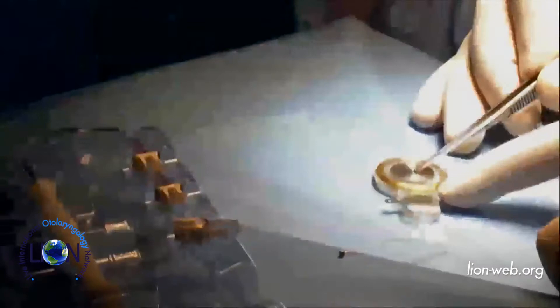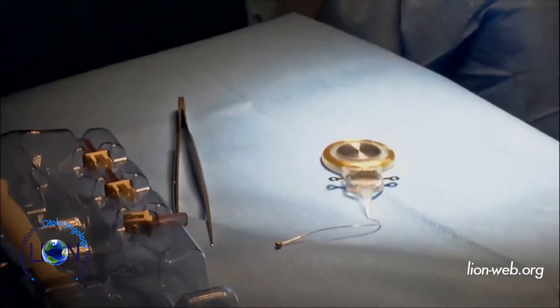The device consists of an electromagnetic vibrator which has to be implanted into the ear, a conductor link, a demodulator, and a receiving antenna. I will take the microscope for a better view.